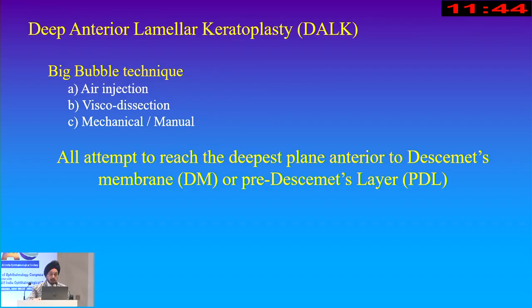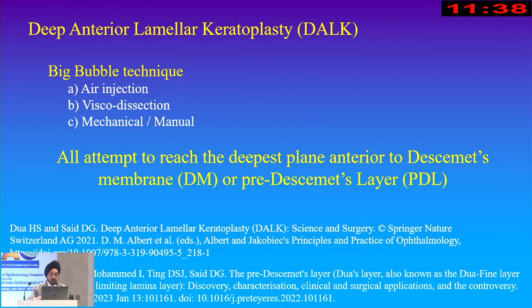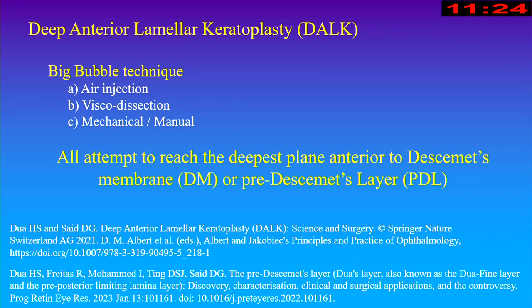All of them attempt to reach the deepest plane, as deep as you can, to the pre-Descemet's layer or the Descemet's membrane. A lot of information on the techniques and the science and surgery are in these two references. The first one is a book chapter, and the other is in Progress in Retina and Eye Research, which is free to download from the internet.